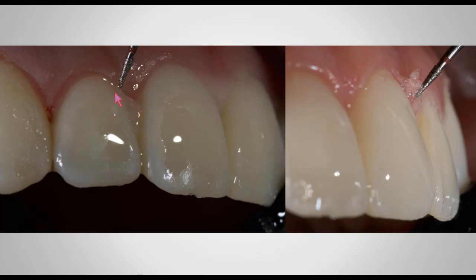And what I do is I just barely cut a little bit into it, and then with the tip of the burr, just like you're seeing right here, without having the burr spinning, it's very easy to remove. It just tears easily apart. And then I use the tip of the burr again, and I go back in, and I make sure that I open the embrasure slightly.